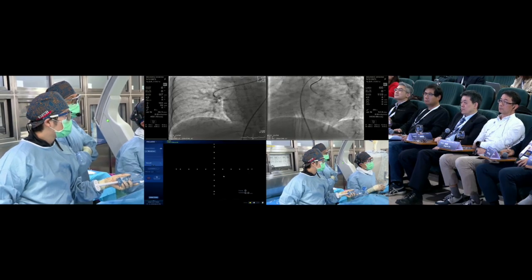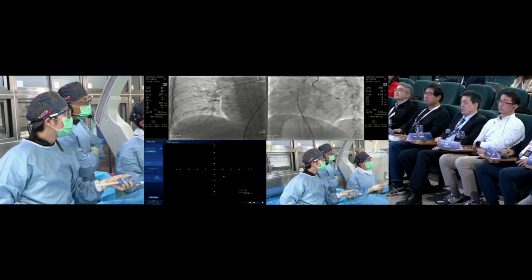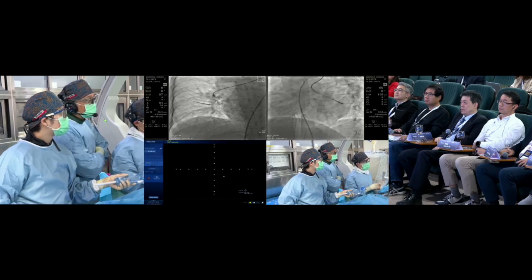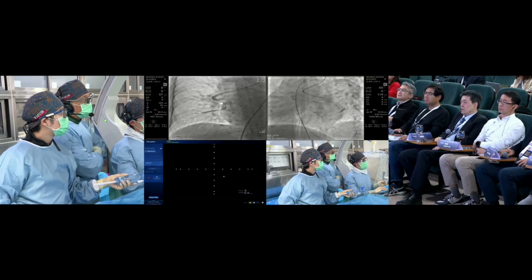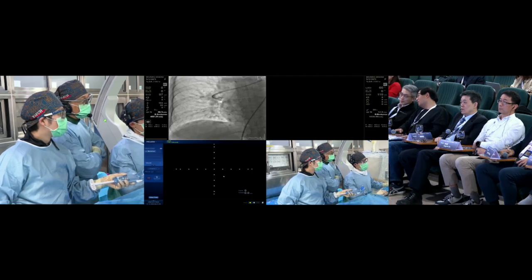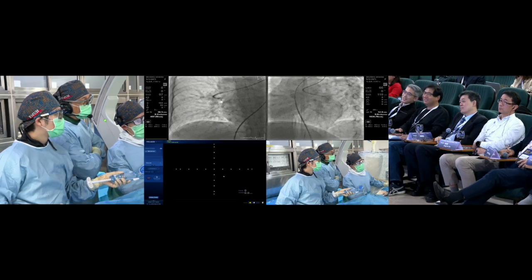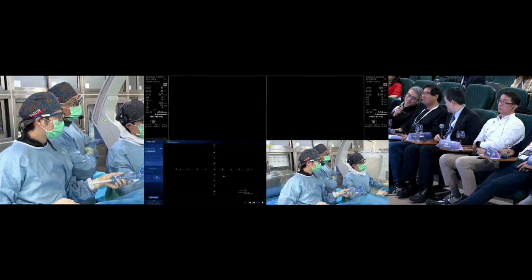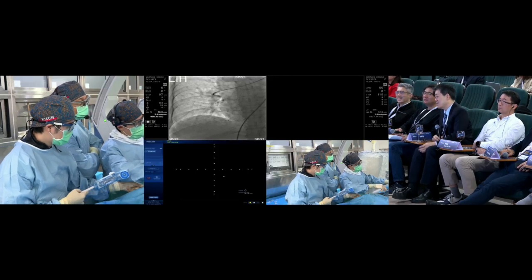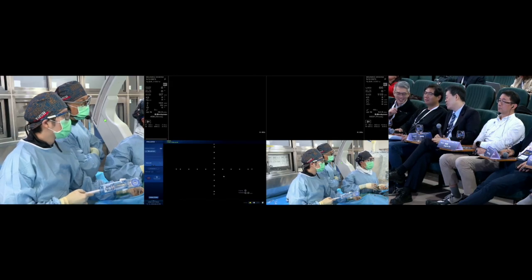Yeah, and I will show you the image after the balloon angioplasty. 要不要再照一张？对。那你要不要先把它推进去一点，让我们看照比较清楚一点？如果可以的话，不行哈，要 prolapse 了，好吧，算了。Okay, we will take the last picture to see whether there's a good venous return.